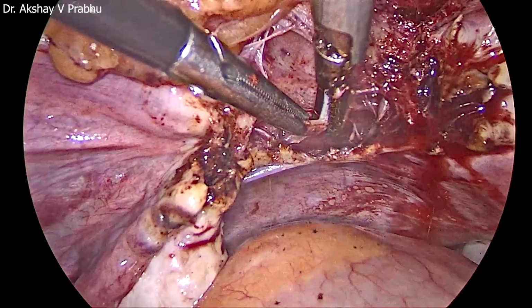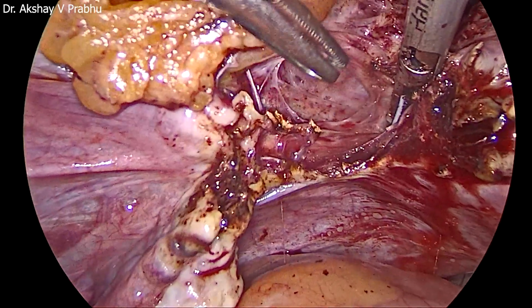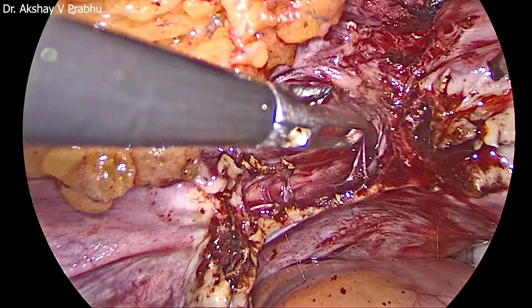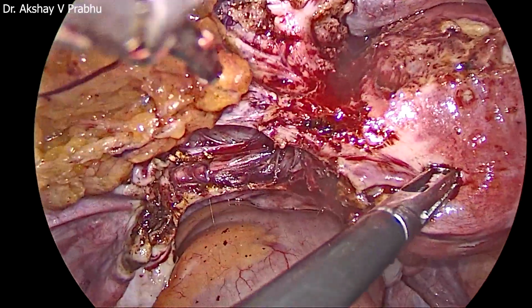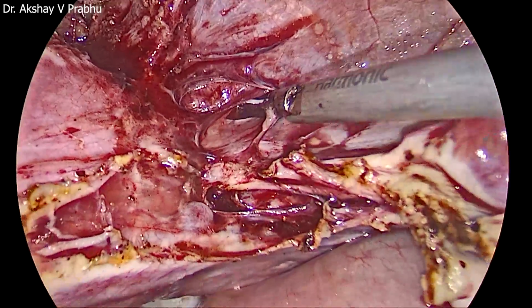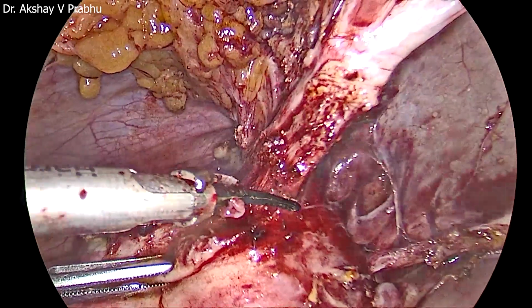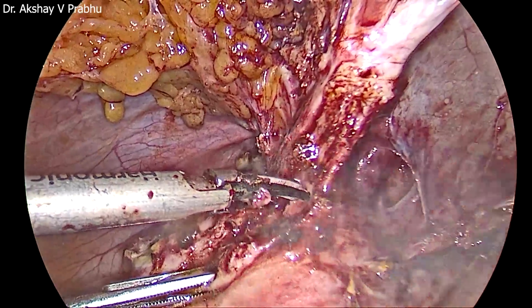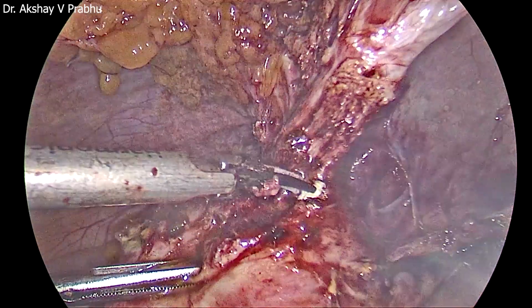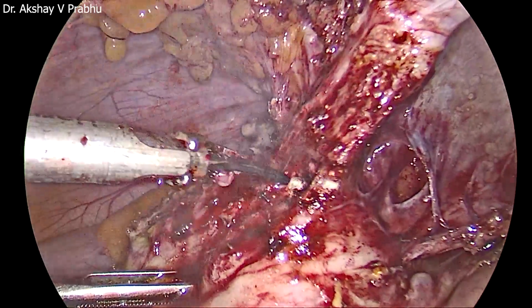So I've got a better understanding of the plane, or at least some plane is opening from the lateral side, left lateral side. Now we can make out the tissue difference, how the virgin plane looks different from the adhesions or the anatomically distorted plane. Now with that understanding, I'm trying to do the same thing on the right side, so that if I can get completely under the bladder, I can put the bladder on stretch and then just cut it from the central aspect. As I've got a demarcation boundary on both lateral sides, I'm slightly more confident in cutting the central band and releasing it so as to reach the bladder.